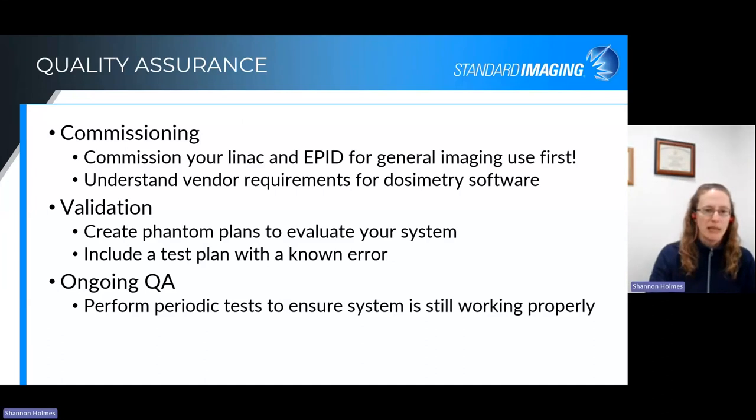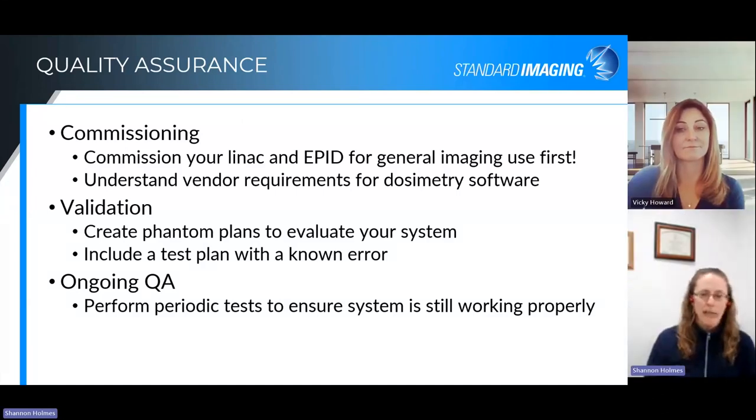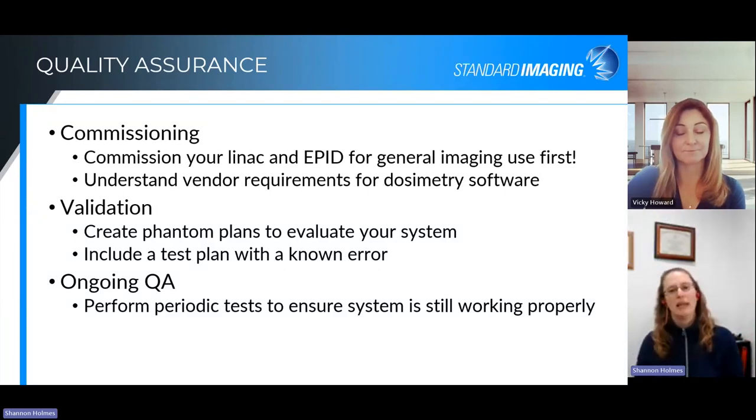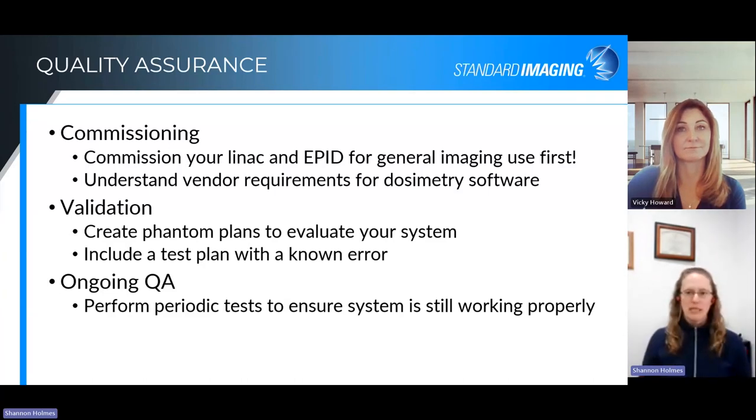So that's where creating those test plans and establishing a baseline for what you expect from your system is so critical. And then, of course, there is ongoing QA. If you pick one or two of those validation plans, you can perform them periodically to ensure that, with a software upgrade or something else that might be changing, your system is still working properly.